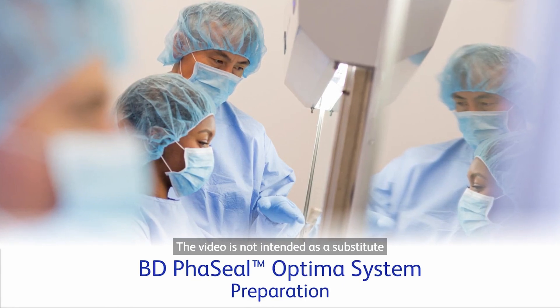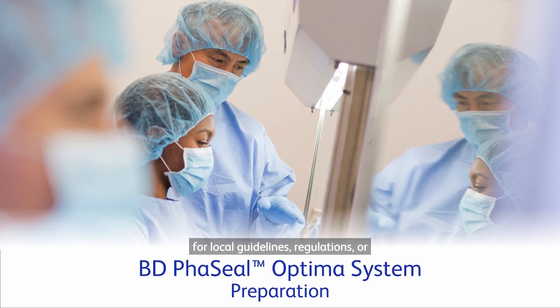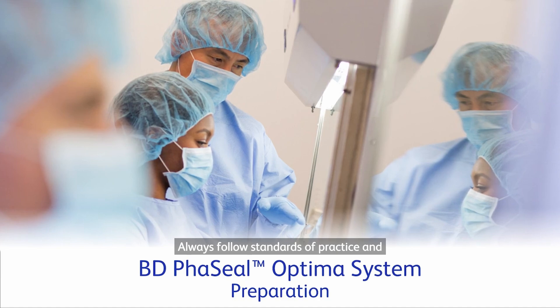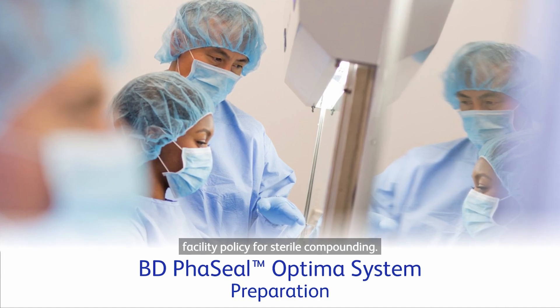The video is not intended as a substitute for local guidelines, regulations, or your facility's policies. Always follow standards of practice and facility policy for sterile compounding.